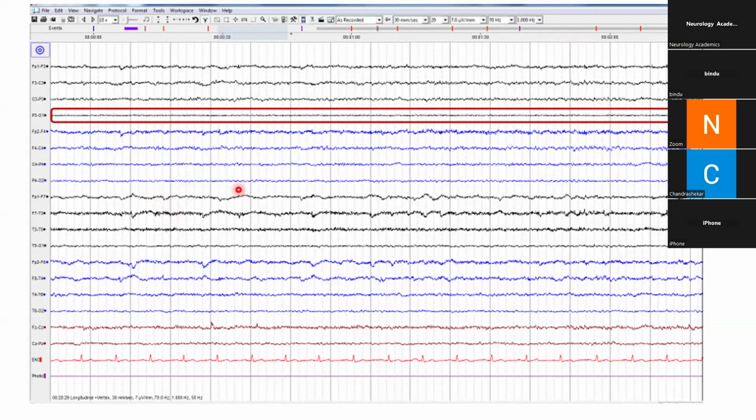But a technologist sitting there may know that you apply a gel between the electrode and the surface of the skull, and that gel is a conductive medium that increases the amount of activity reflected onto the electrode. It increases the conductivity of potentials from the brain to be expressed over the surface. Before that, when there are two electrodes, there should be a potential difference between them to be picked up as electrical activity.